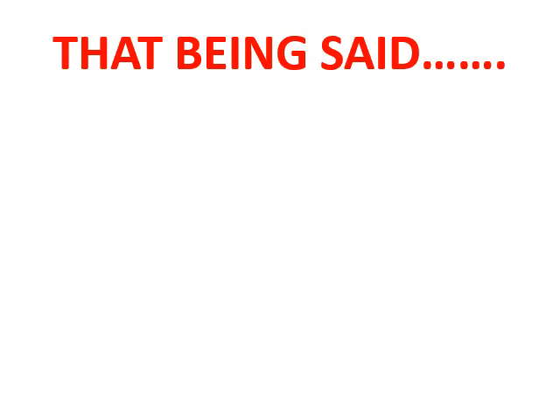That being said, everything that we just learned about what not to do for implants, the individual practice, the individual doctor, will expect you to clean around an implant with the tools that you have. It may be your standard curette, it may be a titanium instrument, and it may be an ultrasonic.